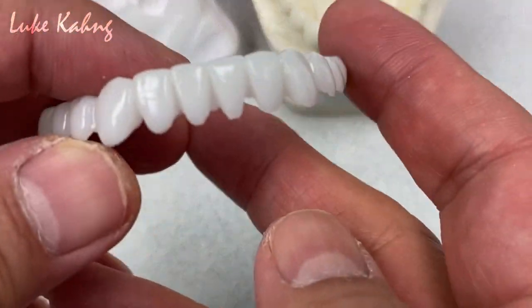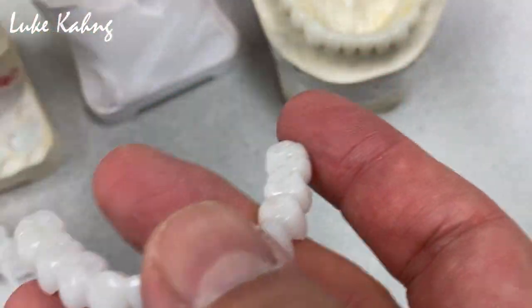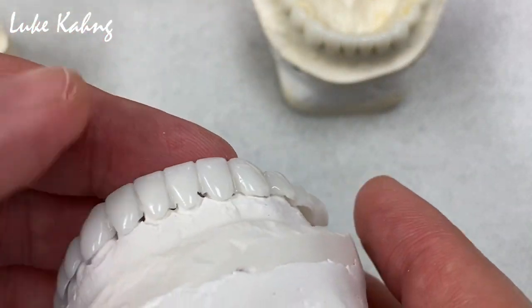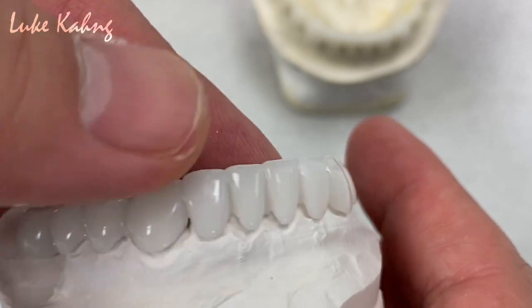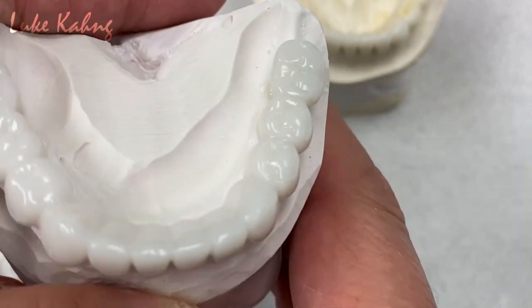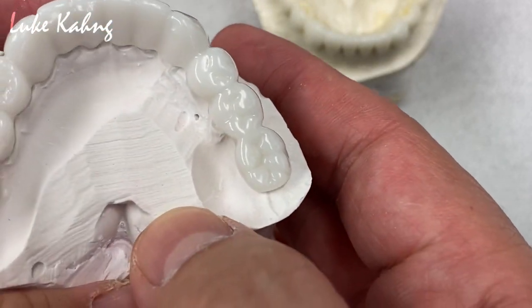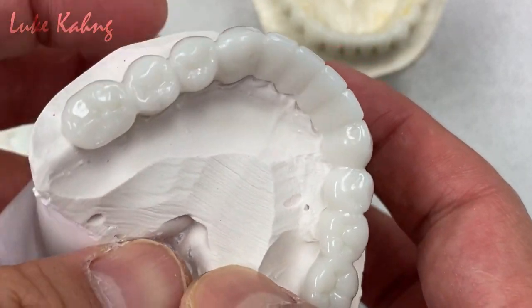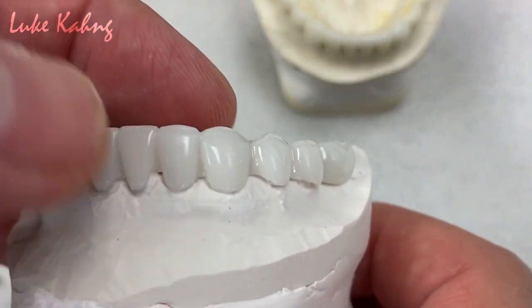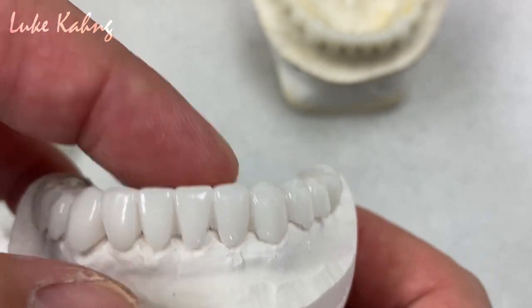Here is the final temporization, so the doctor can reline underneath, like this. We make a good occlusion plane finally, and then the occlusion contact. The proper size and proper contour look good.